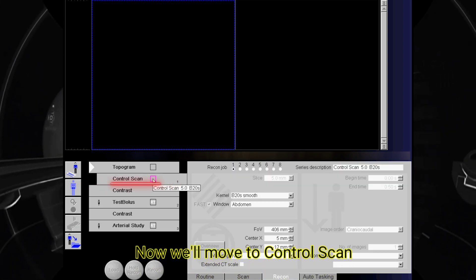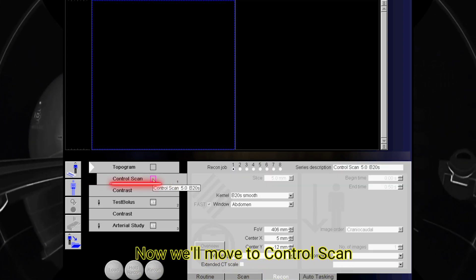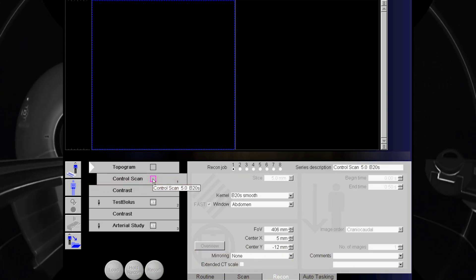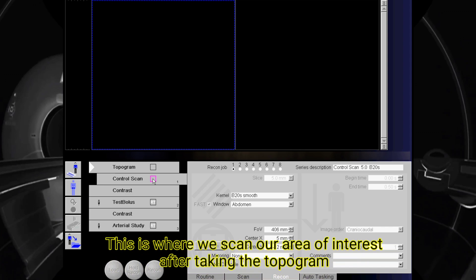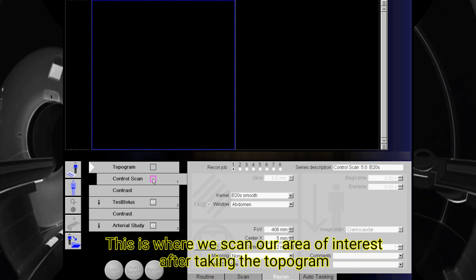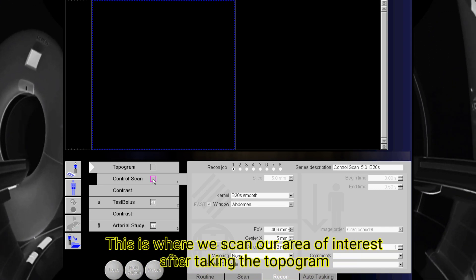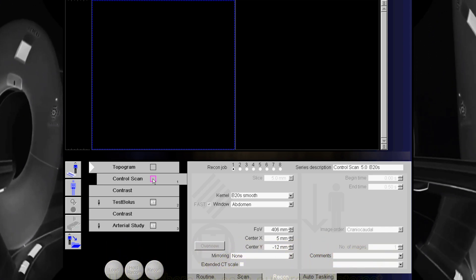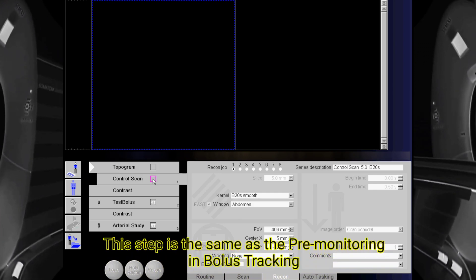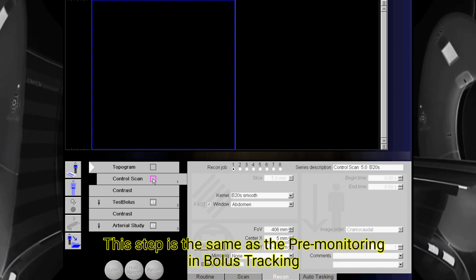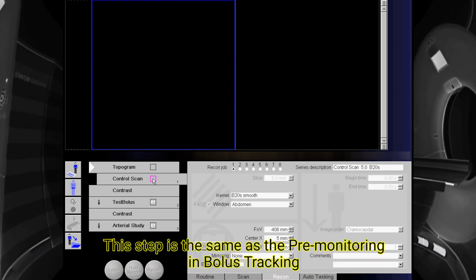Now we will move to control scan. This is where we scan our area of interest after taking the topogram. This step is the same as the pre-monitoring in bolus tracking.